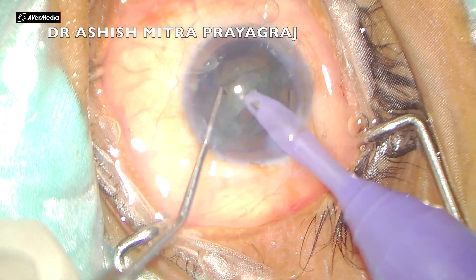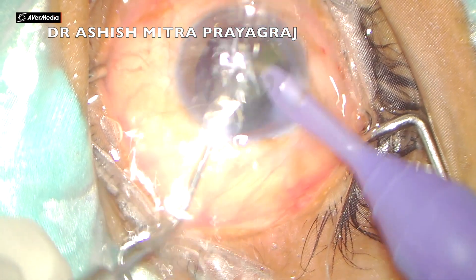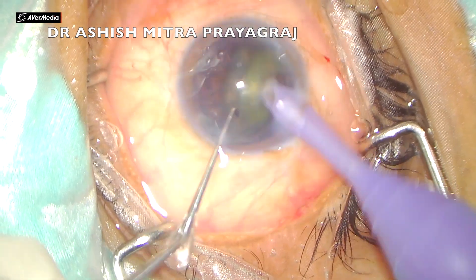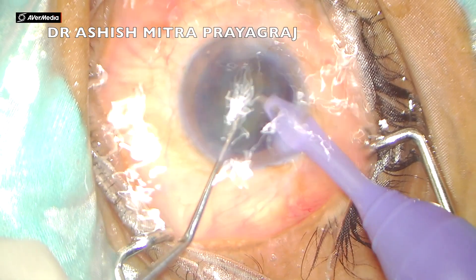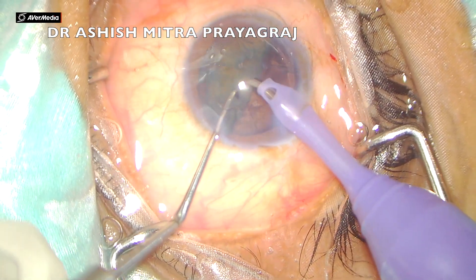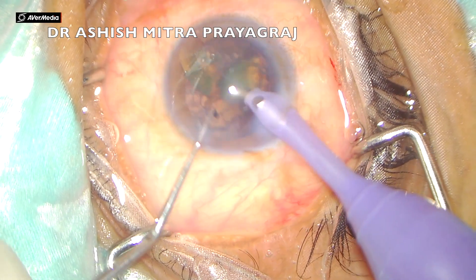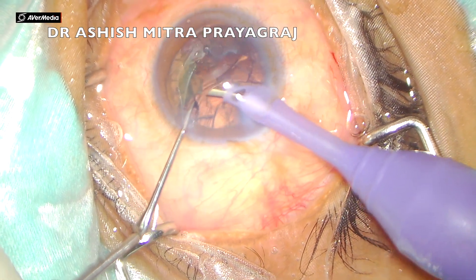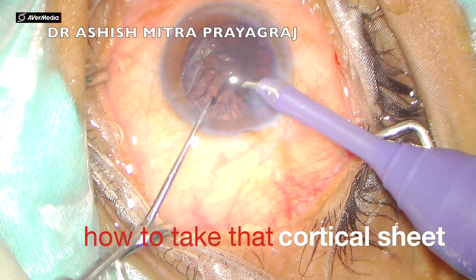Just this one initial crack is sufficient enough — you don't really require any other crack. If you have managed to create two pieces, with the larger rhexis one portion of the nucleus lifts up and actually flips up. One half is already gone, and now the second half can again be aspirated into the central safe zone. And so the title: just one crack will do the job.